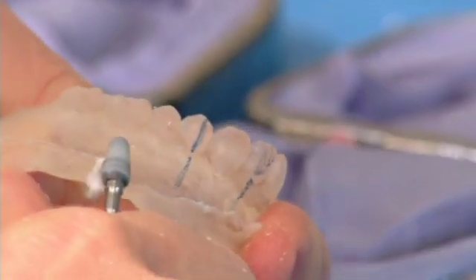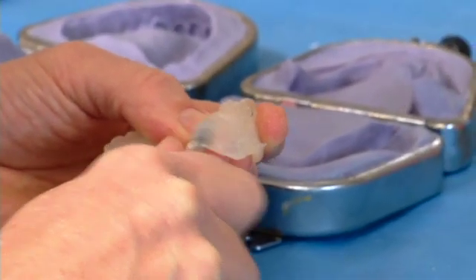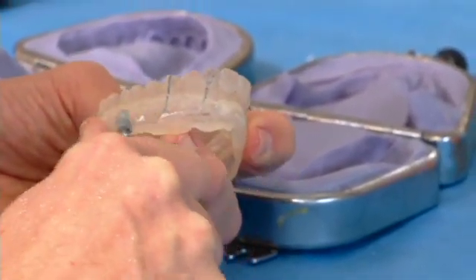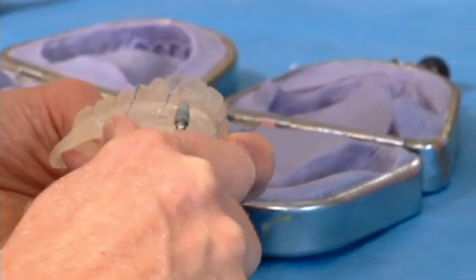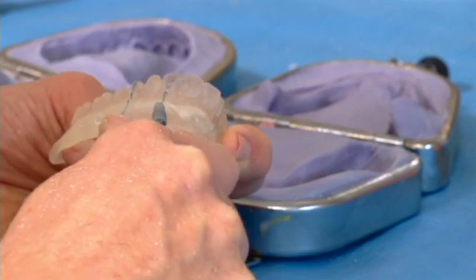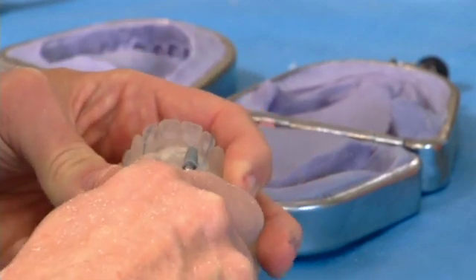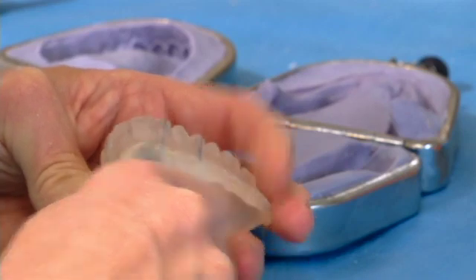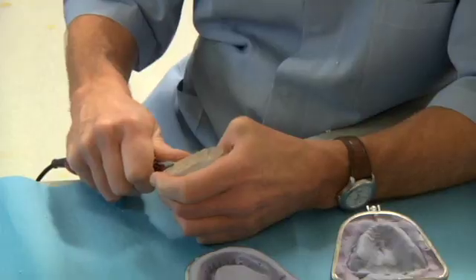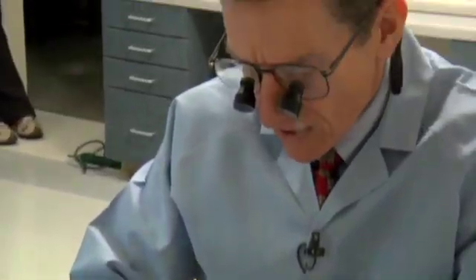The little flash is on the edge. I'll just take it down very quickly. The nice thing about having this as a surgical guide is that even if they have the tissue elevated or flapped, when they put this in the mouth, it will fit over the soft tissues in the areas that are not flapped. Surgeons I work with love having this clear duplicate because it provides for them so much information.